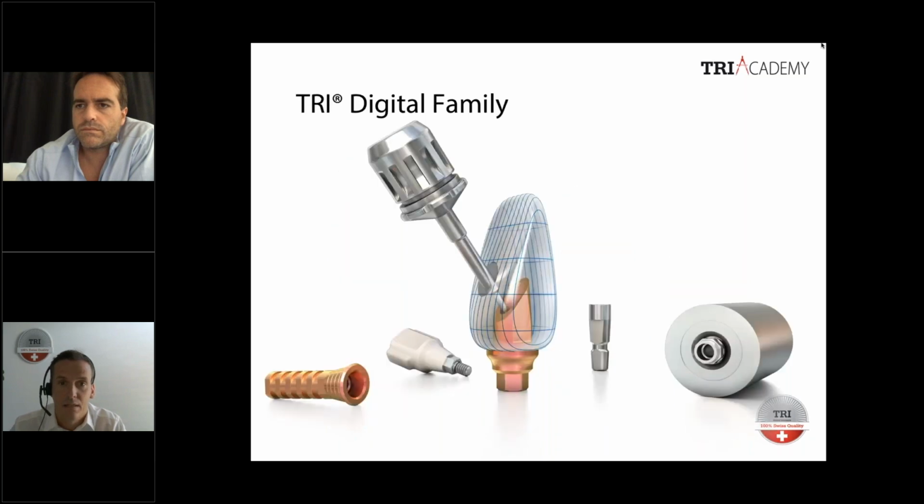Here on the left side, you can see our multi-unit tie base. And in the middle part, this is maybe the focus we have in the presentation of Andrea today. You can see underneath a tie base.